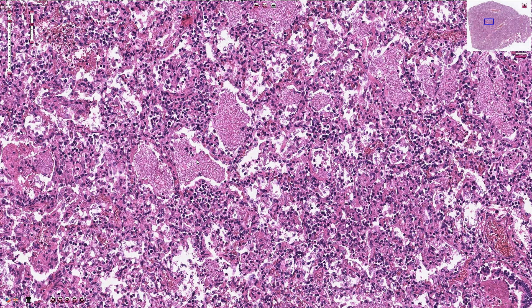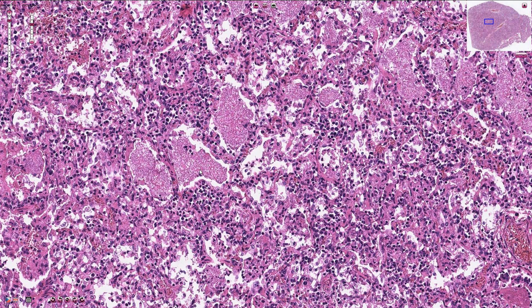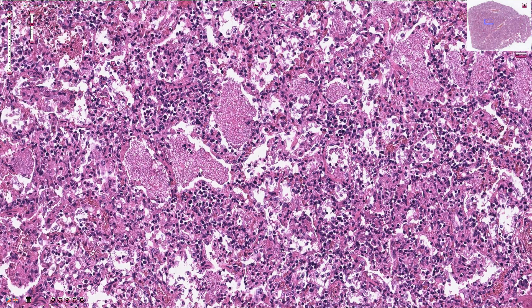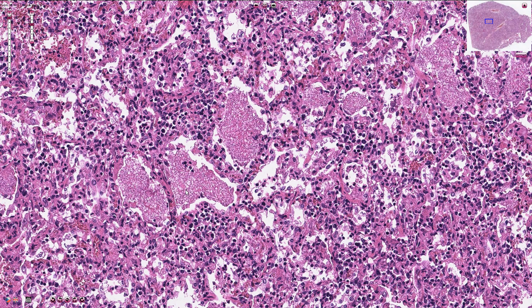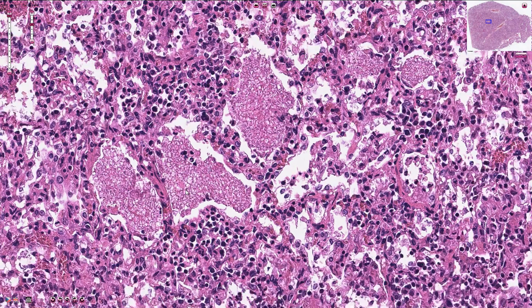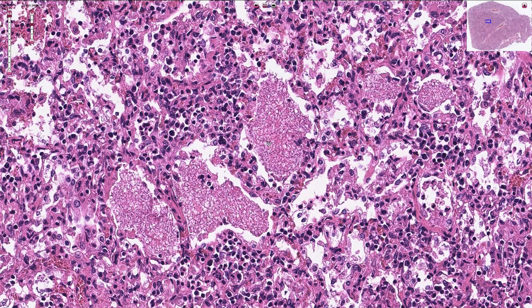We can also use immunohistochemistry — an immunohistochemical antibody designed to stain the Pneumocystis microorganism. This bubbly exudate inside the alveoli here, here, here, and also here is typical for pneumocystosis.